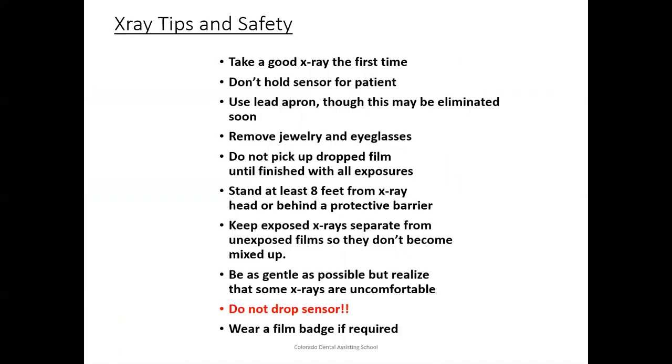Last thing we have for you are some tips in safety. So take a good x-ray the first time. Obviously, all of us want to take a good x-ray the first time. But what I want you to take away from that is, keep in mind that we need to remove earrings for panoramic x-rays, not for all x-rays, just for panos. Keep in mind that you're using the RINN, you have a bullseye, your sensor is on correctly.